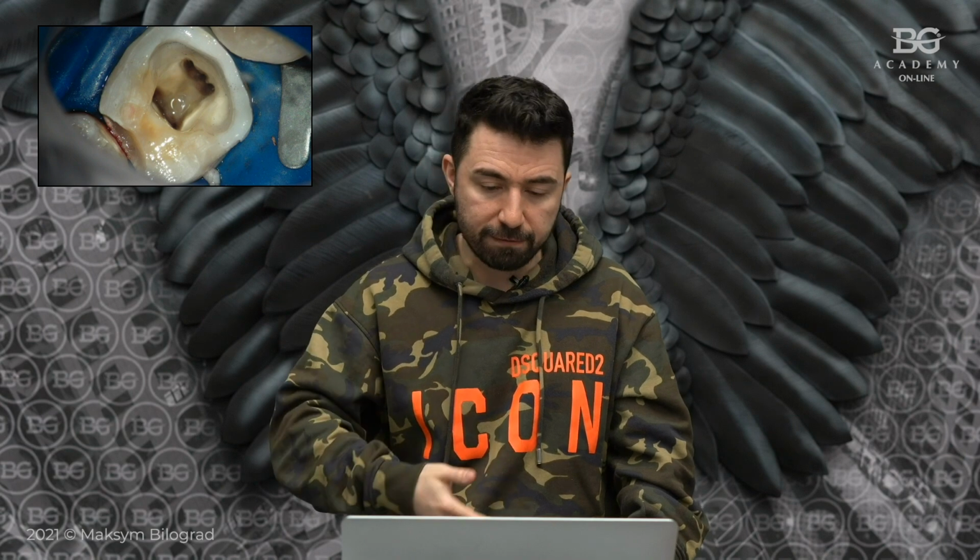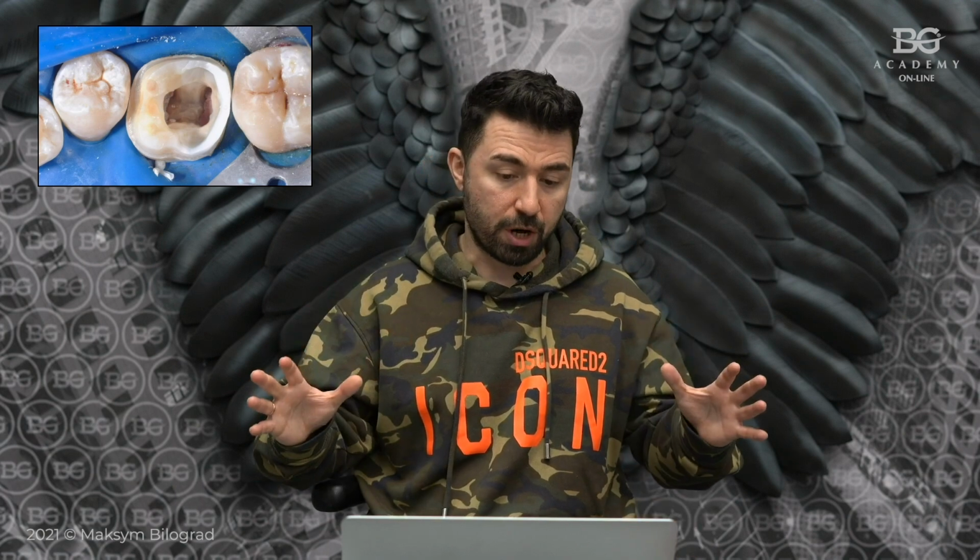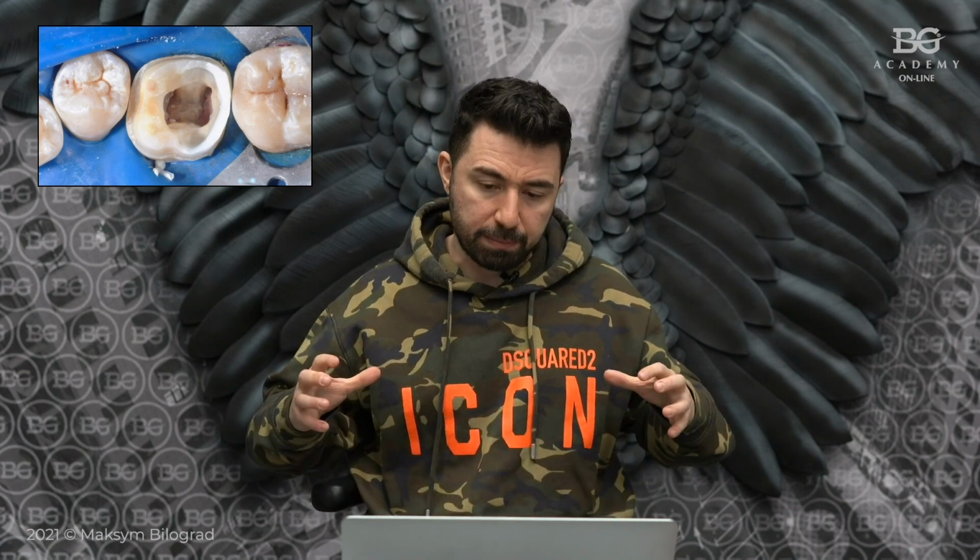So then, after we made that isolation, we do a root canal retreatment. We remove the broken file, we treat the root canals, and then we end up with obturation. Now we are ready for the next step, the restorative component. We use a sandblaster, a very good thing to sandblast the dentin affected by sodium hypochlorite. In this case, we will do a core build-up. We'll use dual cured core composite material to make a build-up.